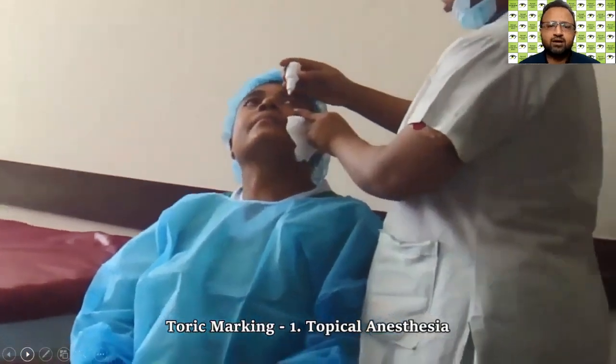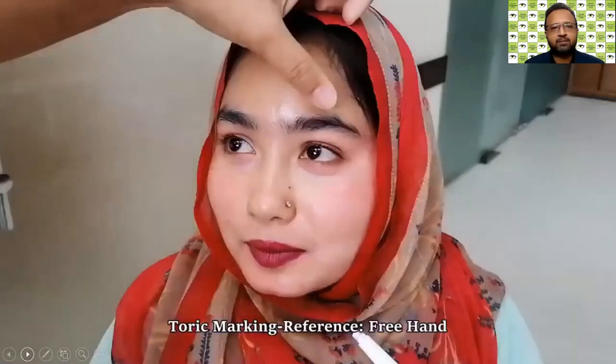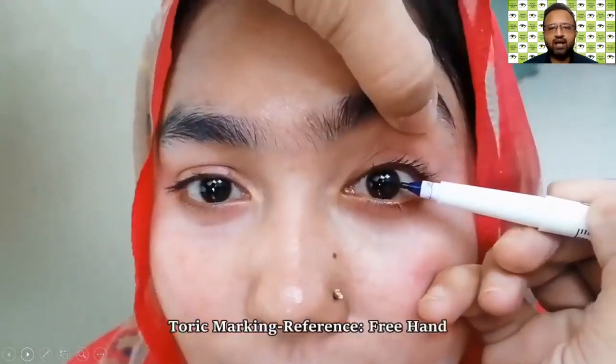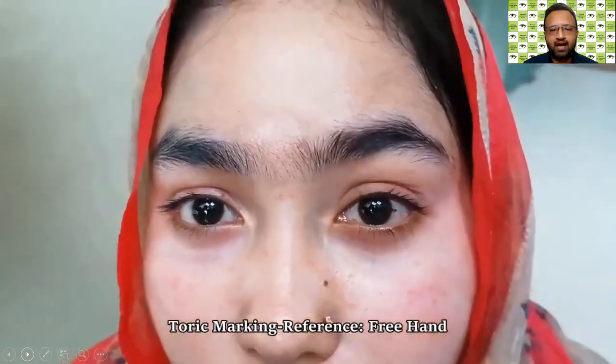Before doing the marking, we need to do topical anesthesia. This is a must, otherwise the patient will not allow us to do the marking. We also have to instruct the patient where to look. And this is the freehand marking. This is the eye, and we just put a line that serves as a reference marking.